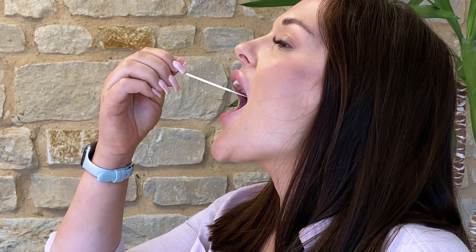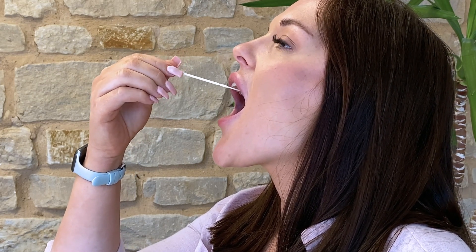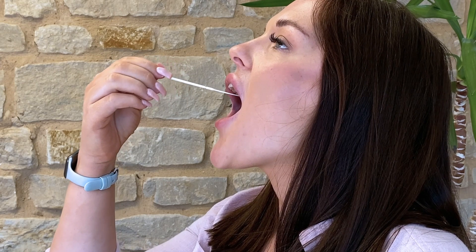Rub the swab firmly against the back of your throat, twisting five times. Now, with the same swab, tilt your head back and insert it into the back of your nostril, rotating it a further five times.